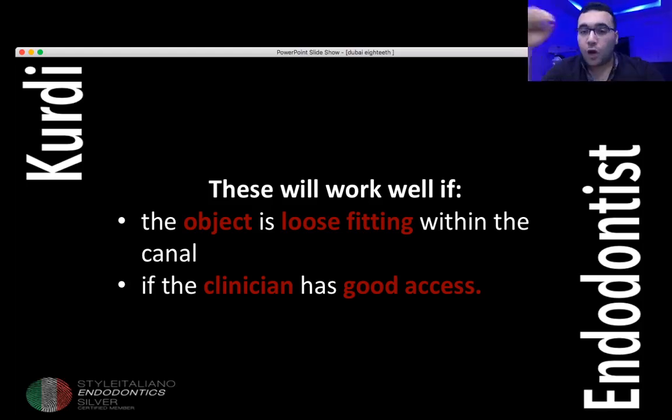to it. Because a lot of people break such instruments in the coronal 1/3 and then they ask me how to remove it, but they don't have a magnification. Yes, they will remove it. As I told in the last lecture, congratulations, you retrieved the file, but you killed the tooth. So again and again and again, magnification is a must. And if the object is not loosely fitted inside the canal, you will just need to make it loose a little bit, and you will just need the ultrasonic at that time.